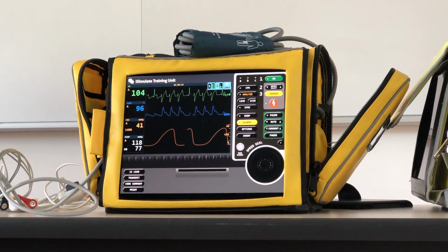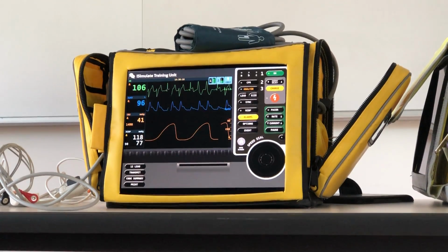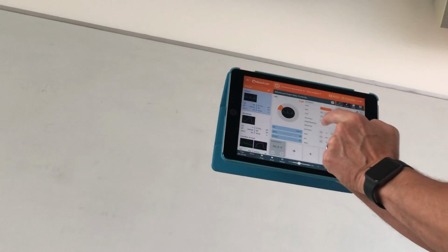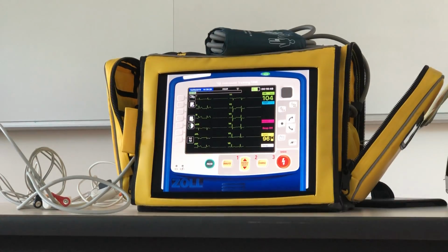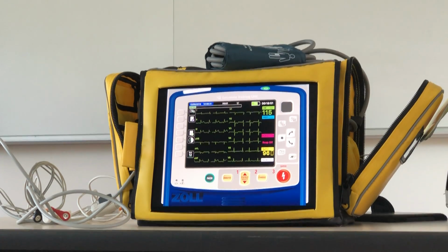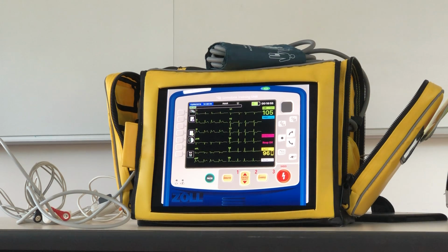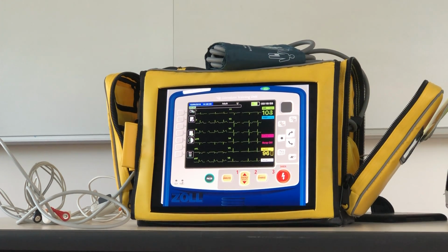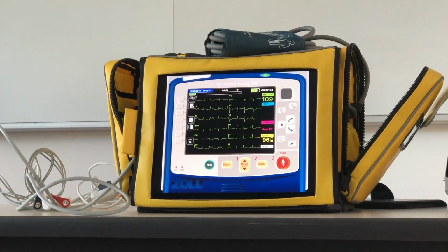Switch it to Zoll and try that. Okay. On the Zoll we should be able to. Again, there's a little monitor button up here at the top. I can go find the monitor that I want. We'll put it back on the Zoll, and then we'll go to the 12 lead on there. Well, see, that's entirely realistic. All you have to do to make ectopy go away is get a 12 lead. It's just poof, it's gone. That's interesting because it's not there.